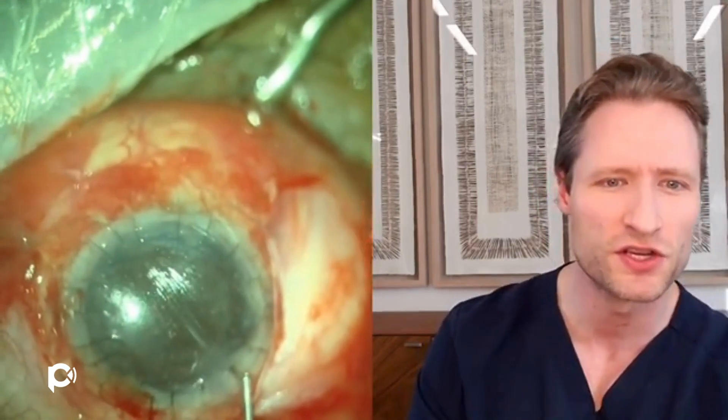I'm also suturing the paracenteses and main corneal wounds to make sure there is no hypotony. At the end of the case, after suturing the conjunctiva and corneal incisions, we have a deep — hyper-deep — anterior chamber with a physiologically pressured eye, and basically zero chance that the chamber would ever be shallow or that the angle would ever be obstructed in the future.